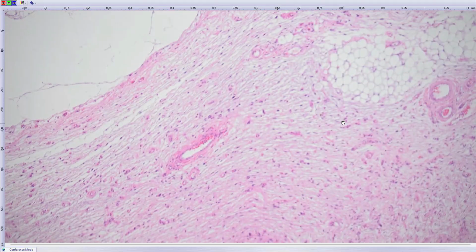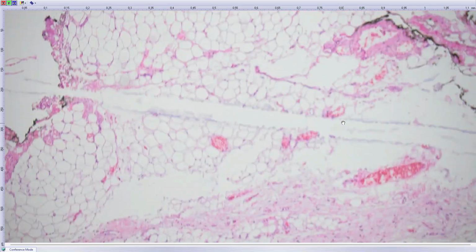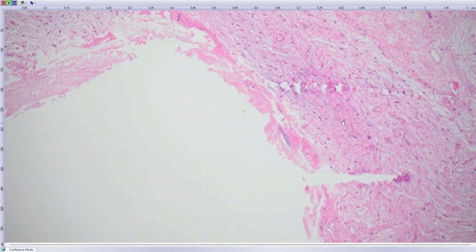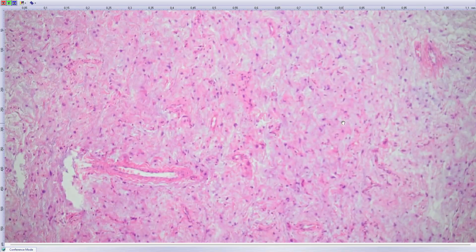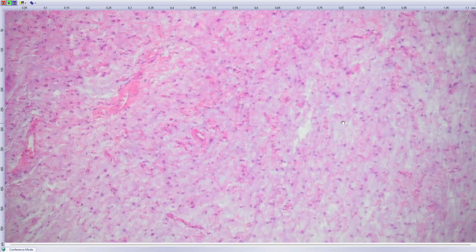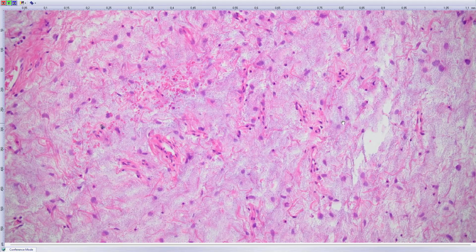Different block. You see even lipomatous tissue here, so the mistake of myxoid liposarcoma or well-differentiated liposarcoma is a very big danger. And even the morphology of this tumor looks the same. It looks like the stroma is crushed by some mixer. When you get into it, you can even have suspicion of this lesion. We have several cases of it, and all soft tissue pathologists should know this pitfall.